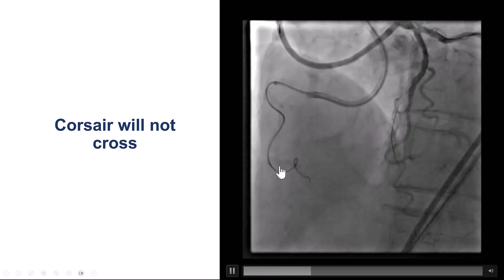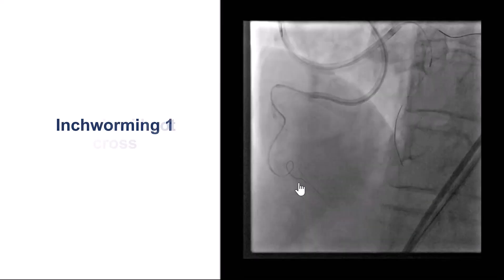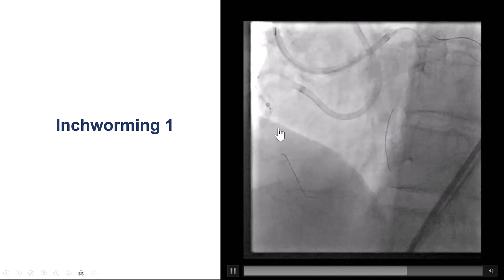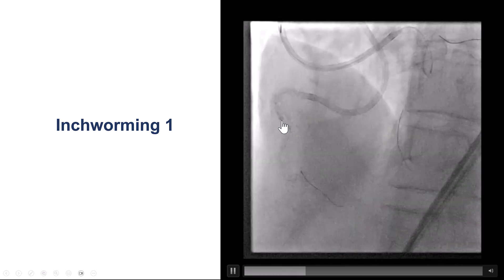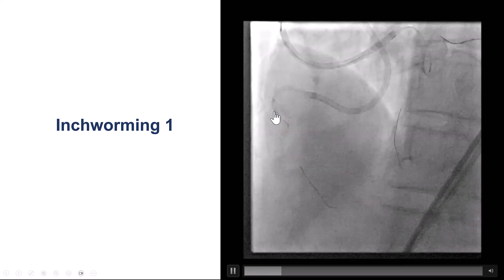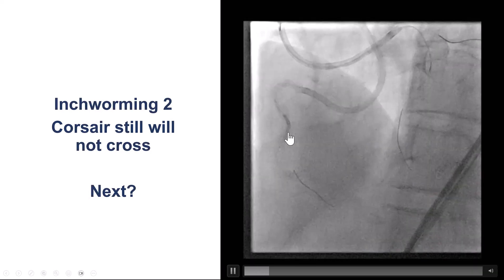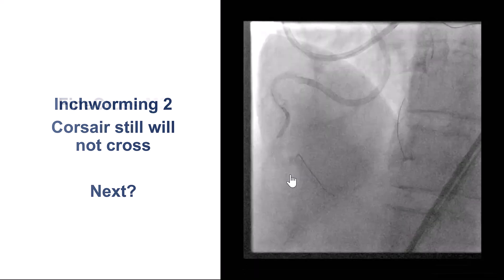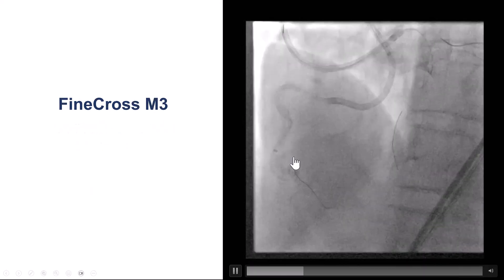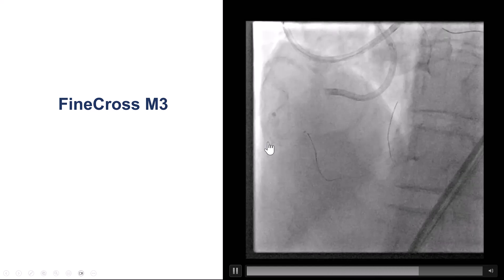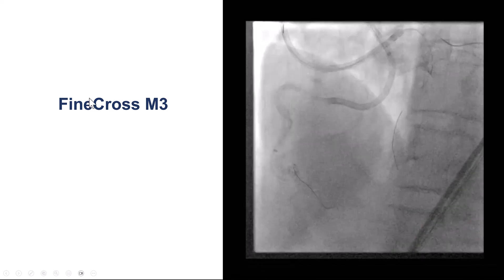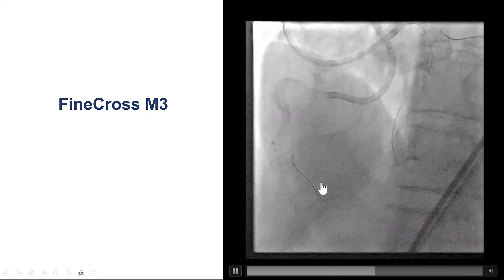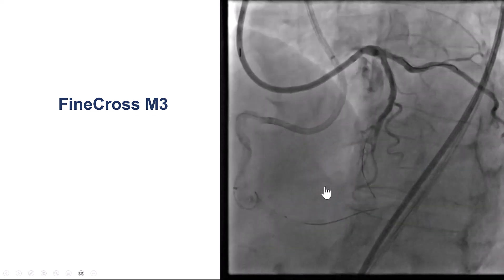Unfortunately, the Corsair could not cross through the 360-degree bend, so we decided to bring the Trapliner guide extension further down using the inch-worm technique — inflating the balloon halfway in and halfway out, then deflating and advancing the guide extension — bringing it all the way down to the distal RCA. Despite this, we still could not get the Corsair through. So we switched to a smaller microcatheter, the Fine Cross M3, which successfully took the bend to deliver to the distal RCA.